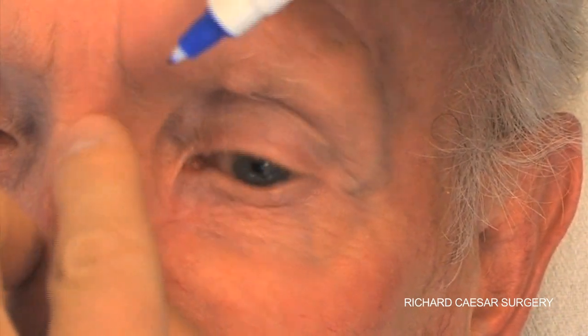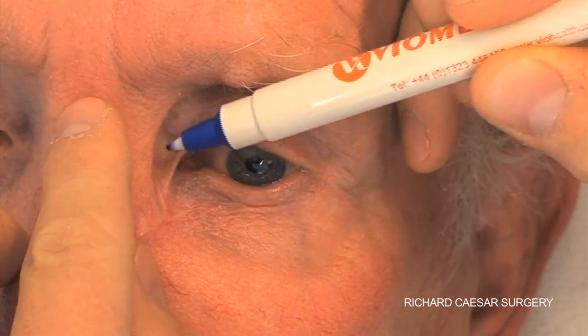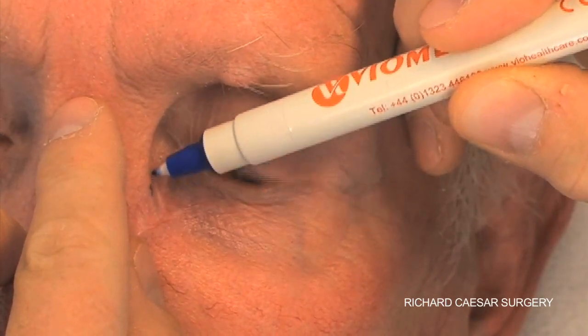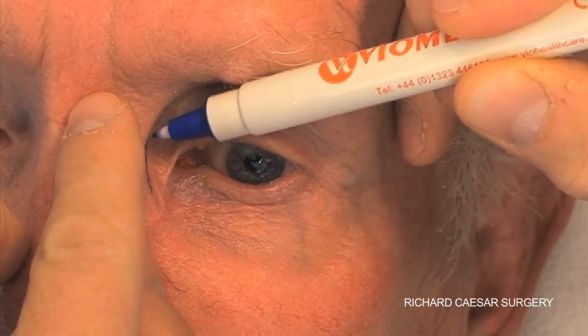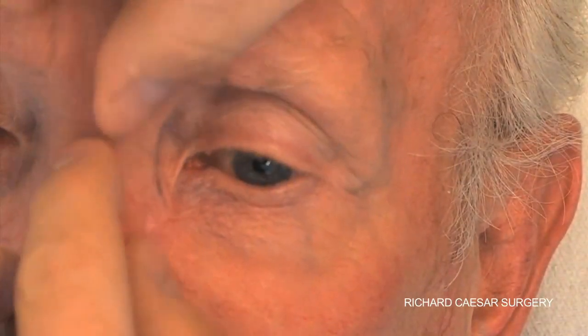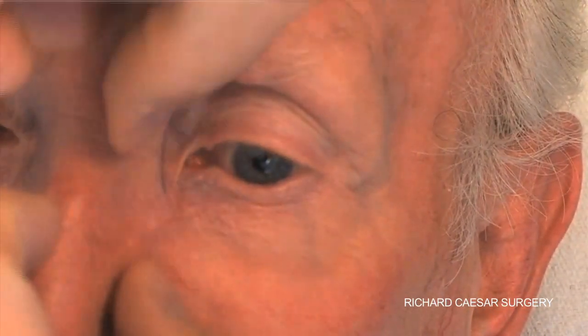The first stage in a Z-plasty is to mark exactly where you wish to place your incisions. This gentleman has a band secondary to a laissez-faire technique for a BCC on the medial aspect of his lower lid.